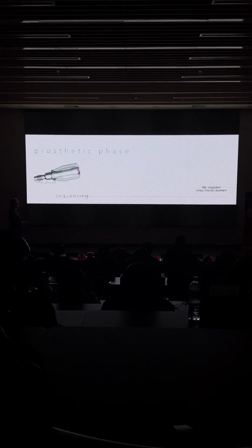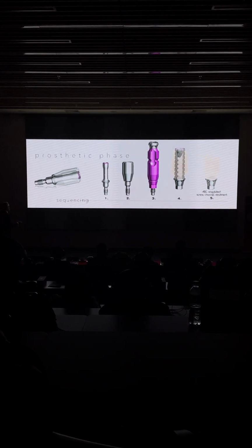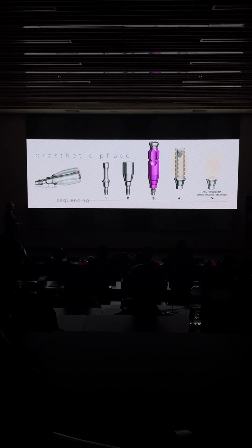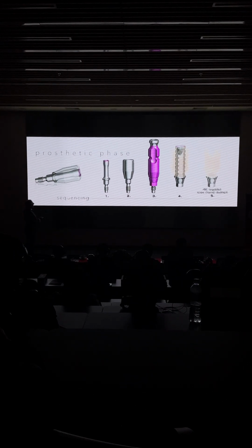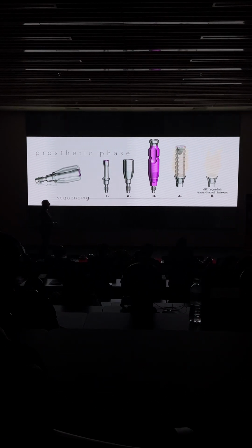So you can see here we have volume, and now it's a matter of trying to push it, and you have different ways of doing it. You can anesthetize, as I told you before. I leave my healing abutment only 3 months. This healing abutment only helps the surgeon. It doesn't help the prosthodontist. So in order to remove this healing abutment, you have to pull it. It's like champagne for everybody. Okay. It stays there, it doesn't come out. You will see it in the videos in a moment.